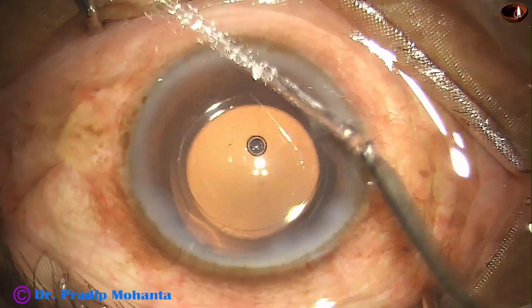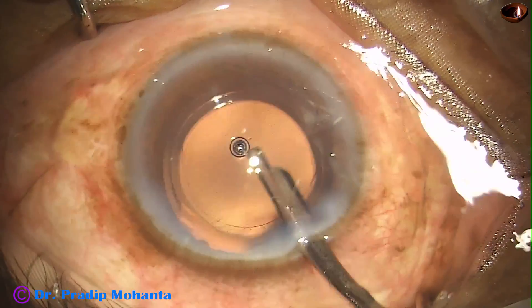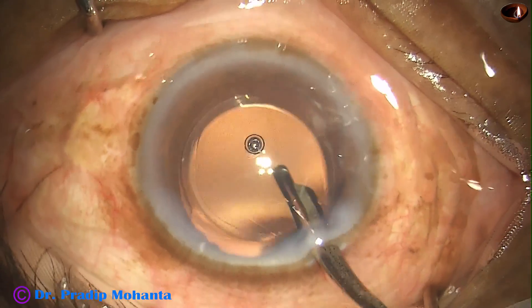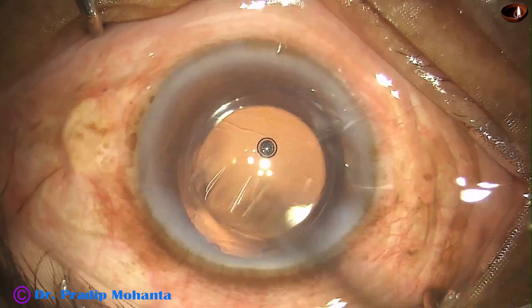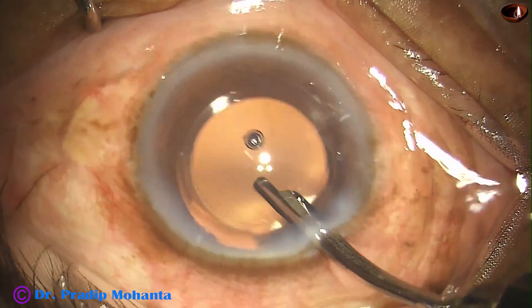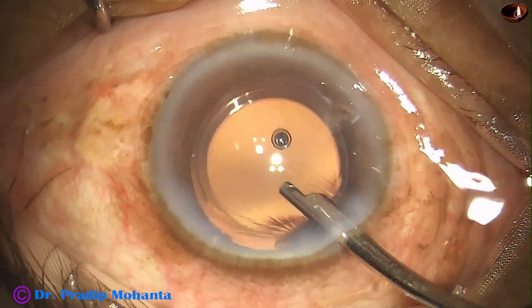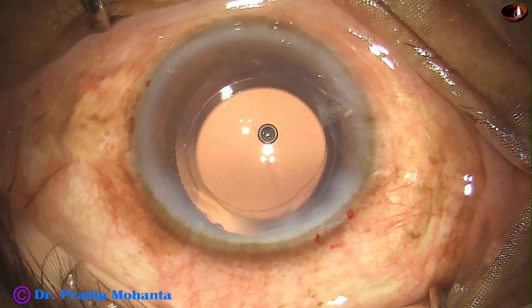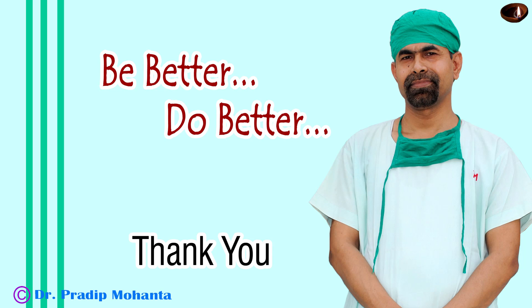Yes, and now this is the final lavage of the anterior chamber. The anterior chamber is nicely formed and the case is concluded. Friends, we are very much grateful to Appa Sami Associates. They have helped us in our practice so much, and their after-sales service is free — they never ask us to go for an annual maintenance contract. Thank you very much for your attention. Hope this video will motivate you to consider the TrueGlow microscope from Appa Sami Associates for a demonstration.